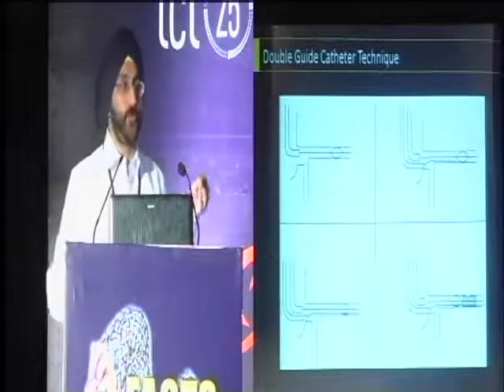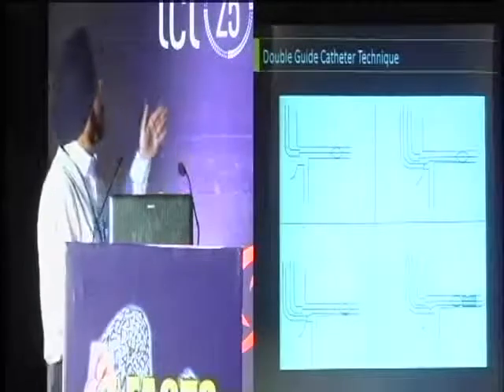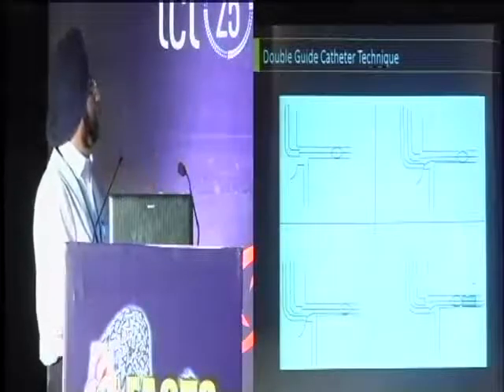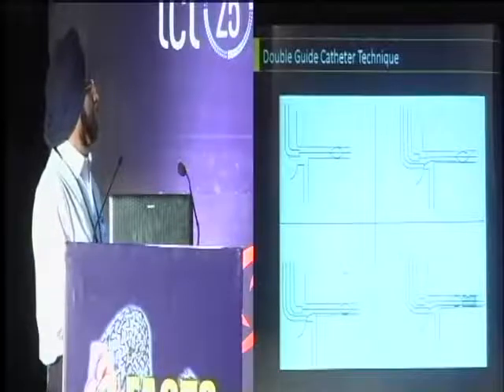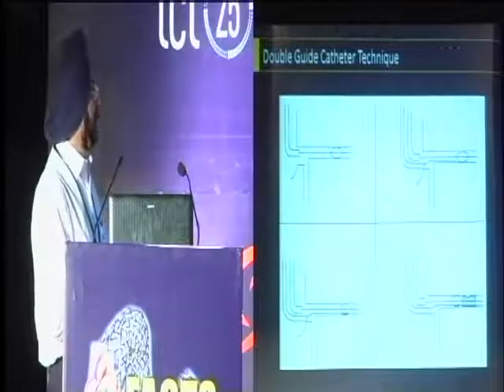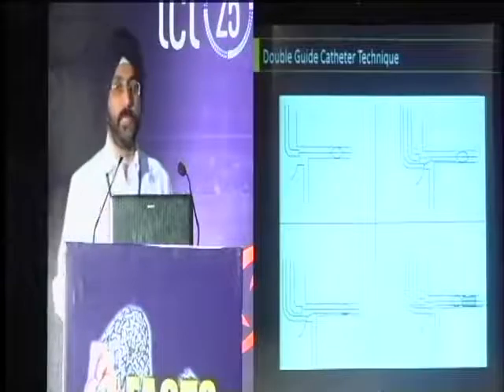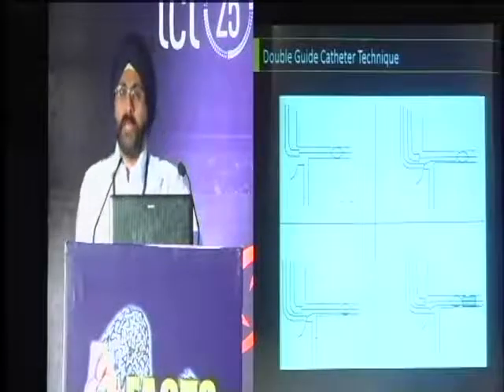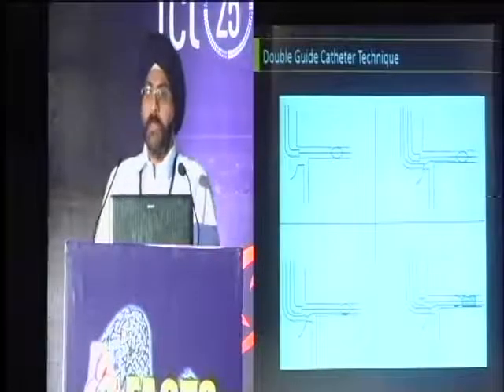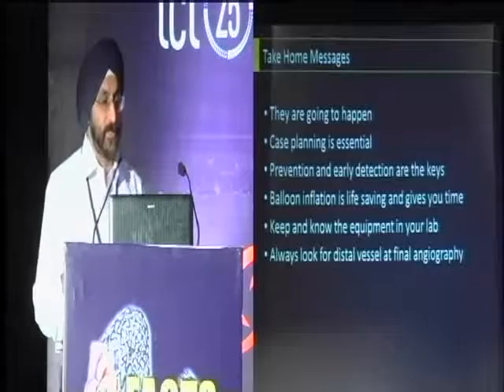So what you do is puncture the other side, first give a prolonged inflation with a balloon, take that guiding out, then put another guiding and slightly deflate it so that the wire is taken out, then take the stent nearby, slightly deflate the balloon and put the covered stent over there. In that way, you will get some time to prevent a massive tamponade, and you will be able to put a stent graft in these particular situations.